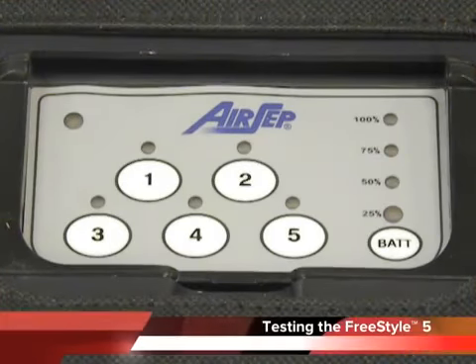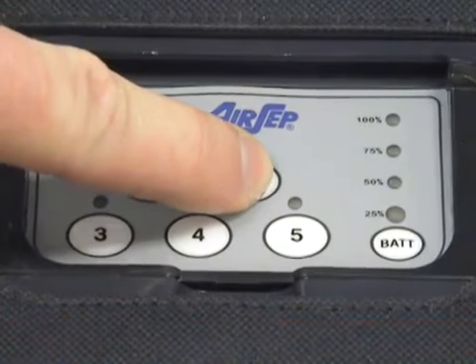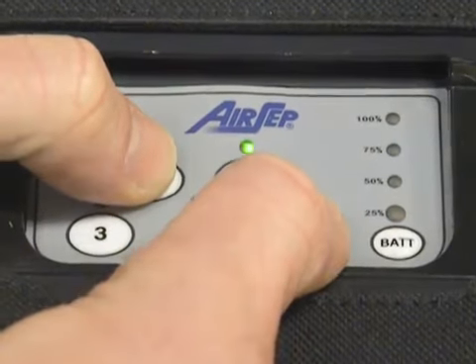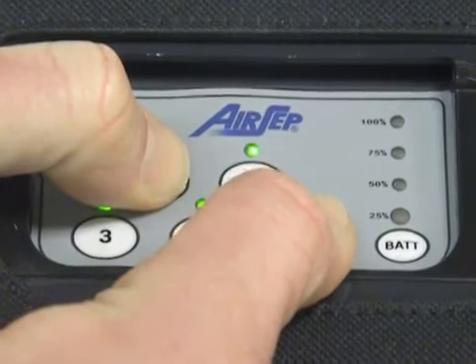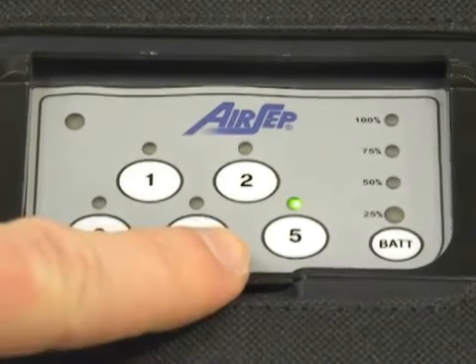To put the Freestyle 5 into test mode, press the 2 button to turn the unit on. Once the unit turns on, let it warm up for about 10 seconds. Once 10 seconds passes, press the 1 and 5 button simultaneously and hold down for 5 seconds. Once test mode is entered, all 5 LEDs will light up and the unit will begin auto-pulsing in a pulse setting of 5.